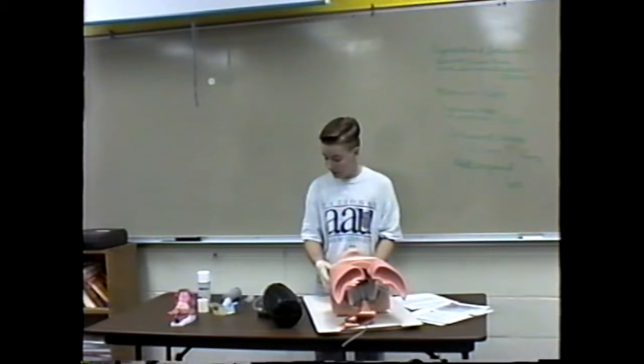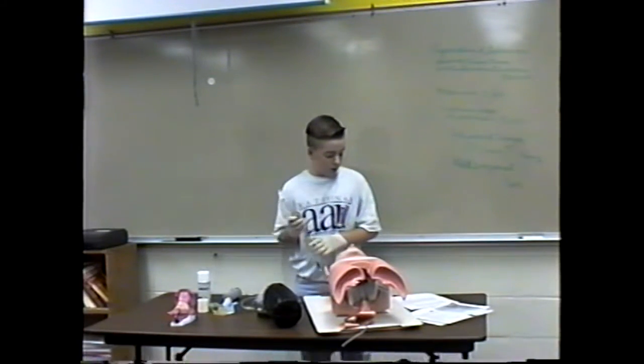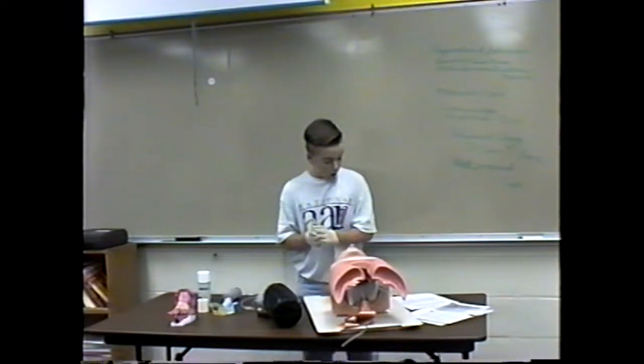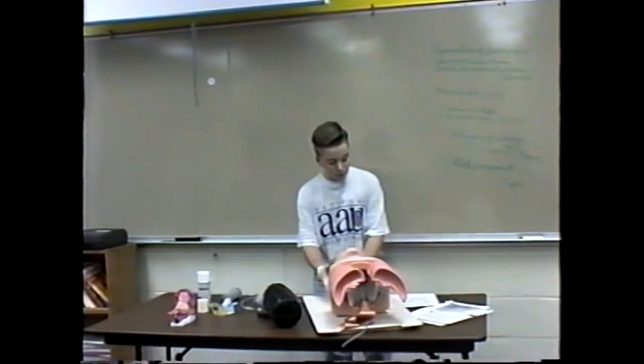An endotracheal tube can be inserted by a paramedic, an emergency medical technician paramedic, and a combo tube can be inserted by an emergency medical technician, basic, or either intermediate or paramedic. To practice different kinds of intubation, we will be using Fred the Head. That's what its name is. Now we are ready to begin intubation.